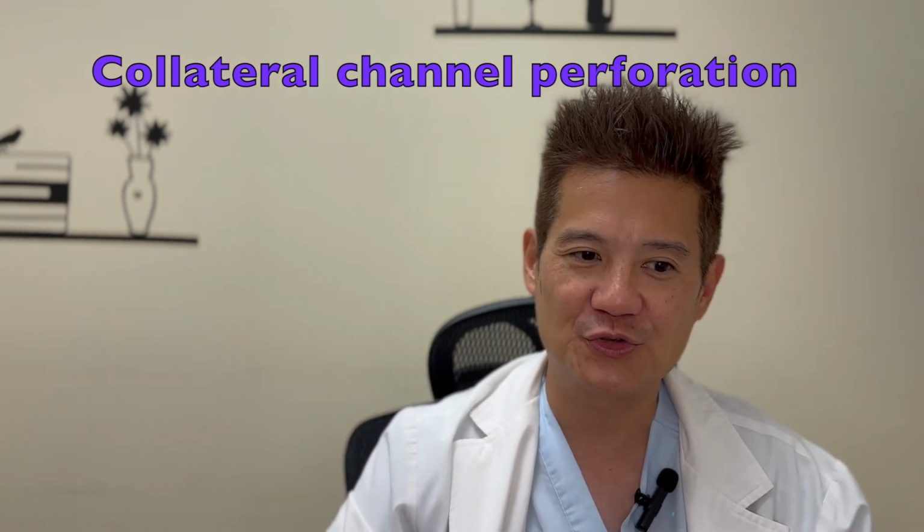So if you have a distal perforation, usually I would try to coil it or do fat embolization, thrombin embolization, whatever you're used to, to stop the bleeding before you send them up, rather than just leave them. Okay, the final part is collateral perforation.